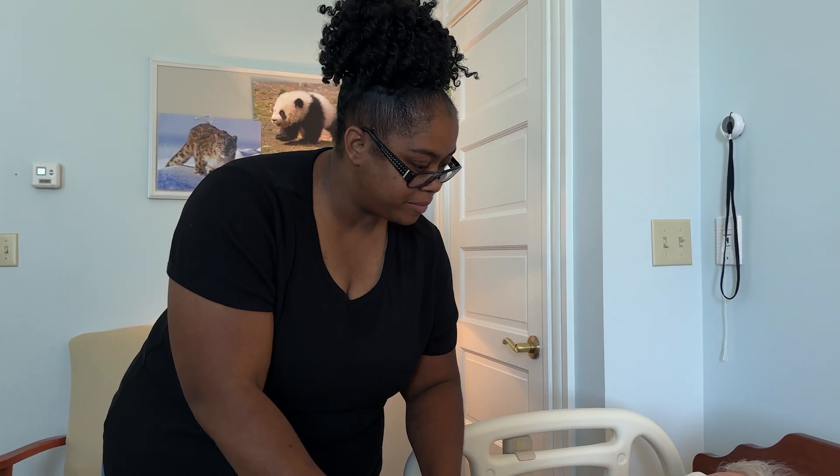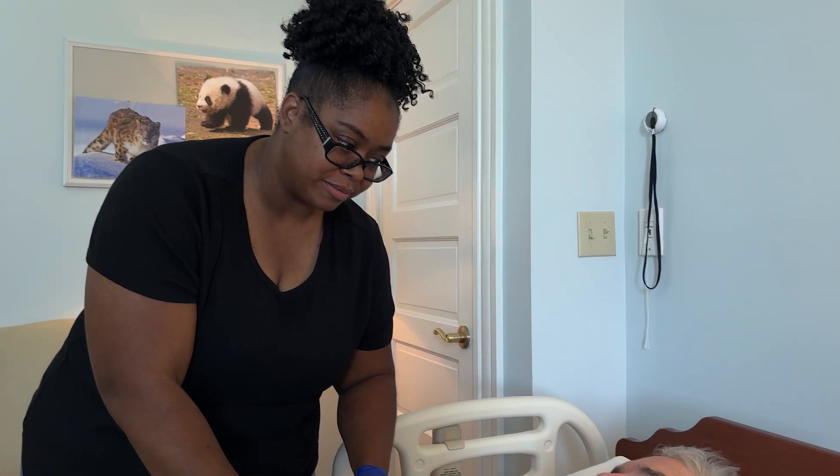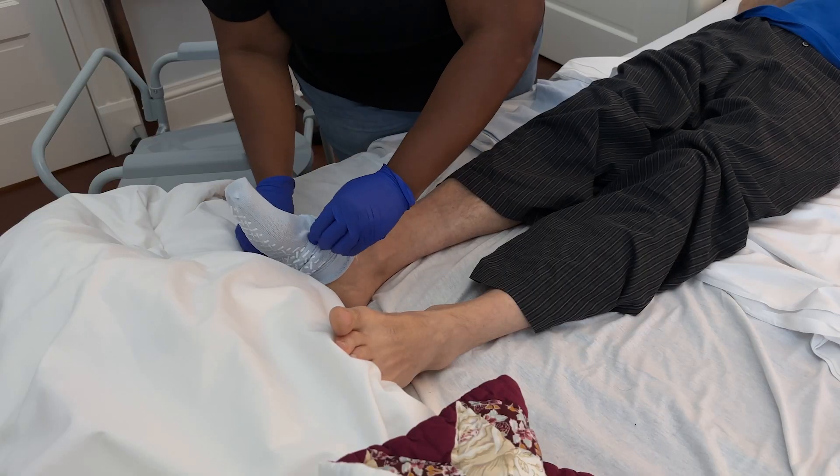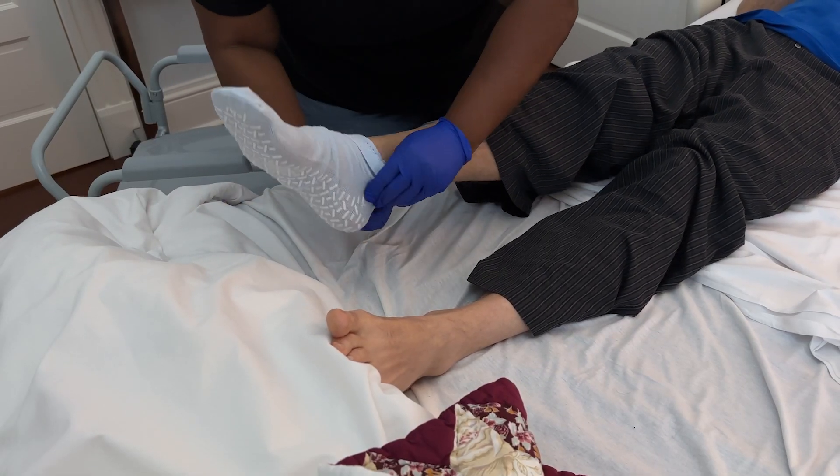Communication is crucial. Explain the transfer process to your loved one and reassure them of their safety throughout. Your loved one should have socks with grips or slippers to ensure their feet will not slide when getting up.